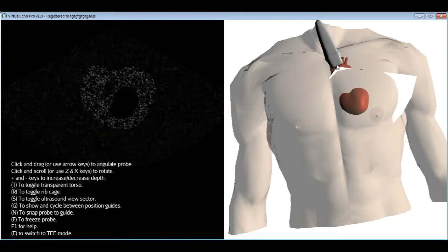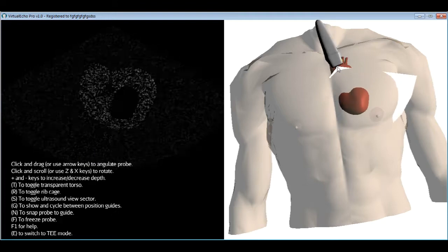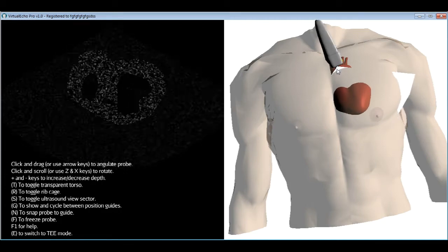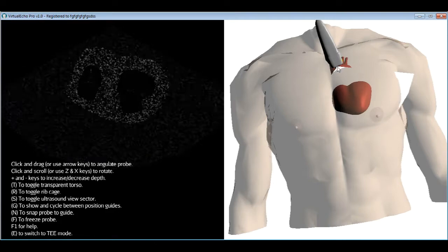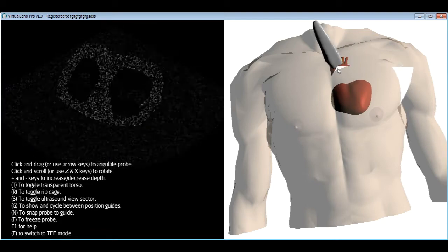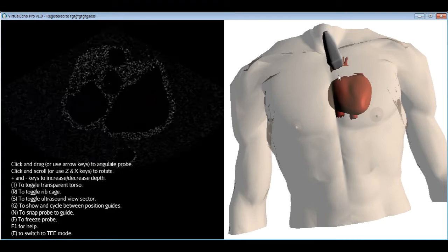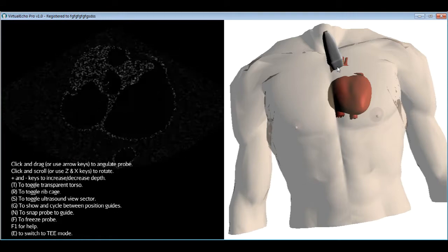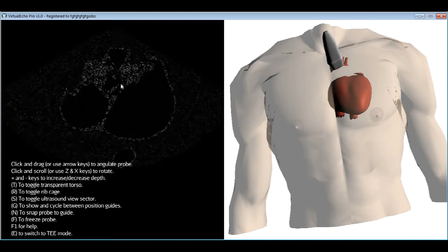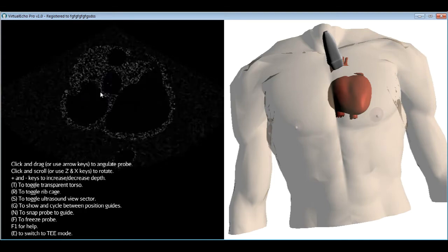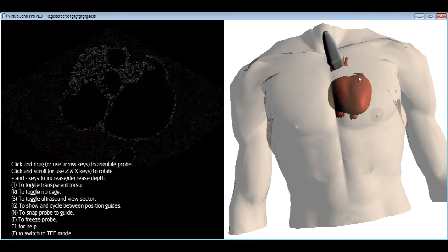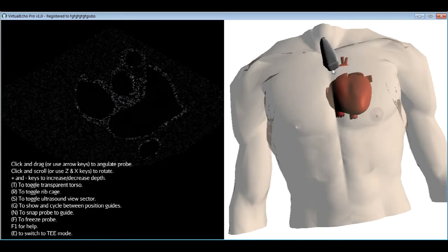Angulating further caudally gives the apical view, showing the apex of the LV — useful for assessing segmental wall motion abnormalities in the apical region, while the mid-cavitary level allows assessment of mid-cavity wall motion. Angulating all the way cranially brings you to the base of the heart, where the aortic valve leaflets are visible opening and closing in the form of a triangle, with the aorta cut transversely head-on.